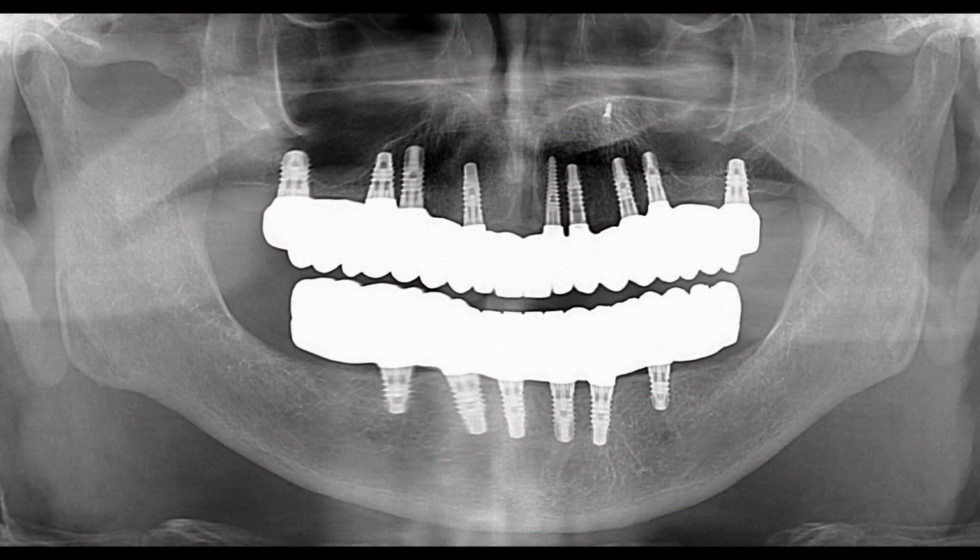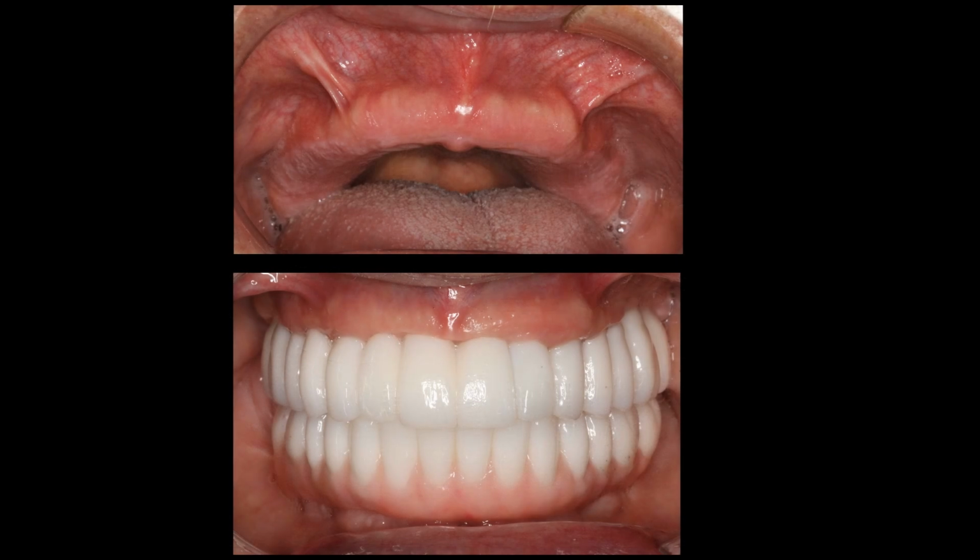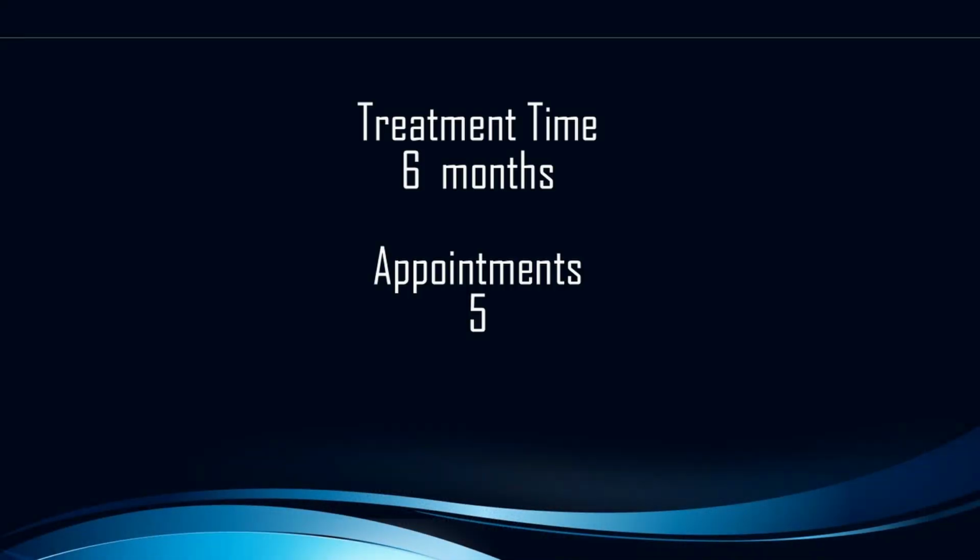His final panoramic x-ray. Before and after lips retracted. And his final smile picture. His case did take 6 months, 5 appointments. He lives in Dallas, so he had 4 trips to our office, 5 appointments total, where we piggybacked 2 of them.